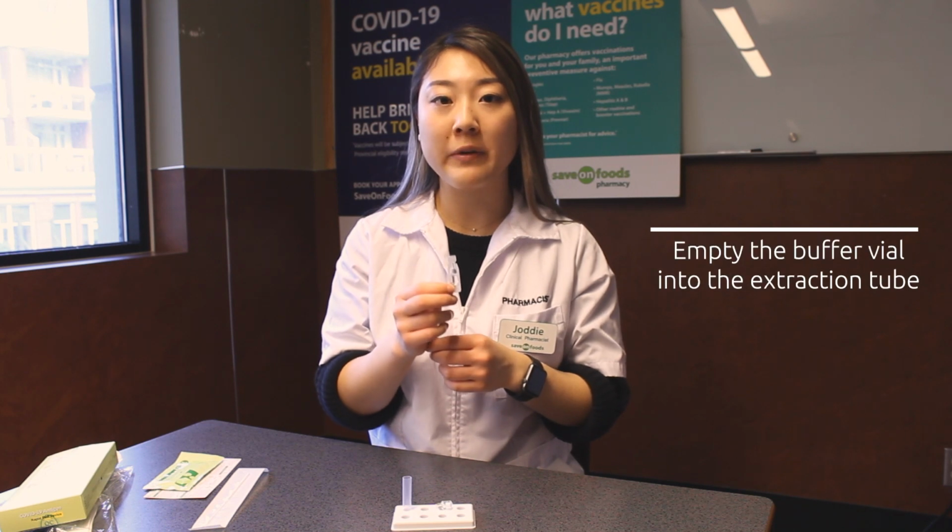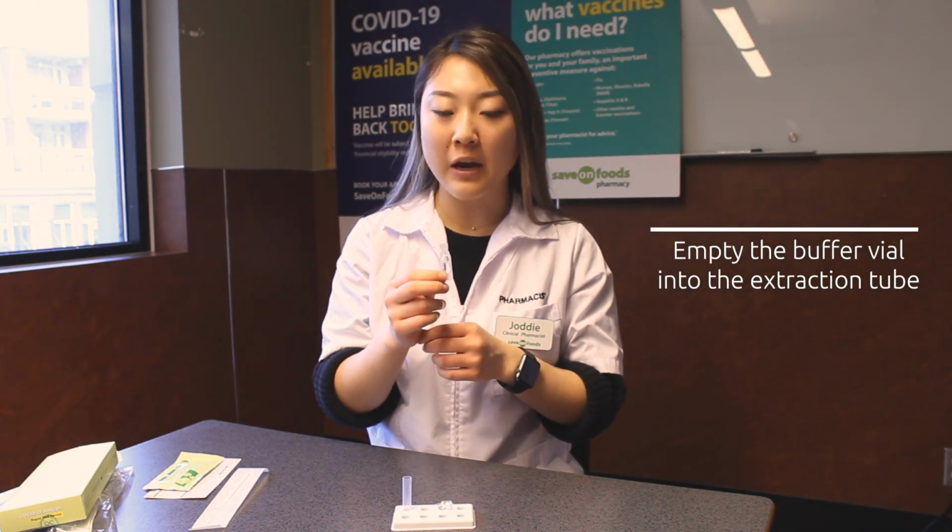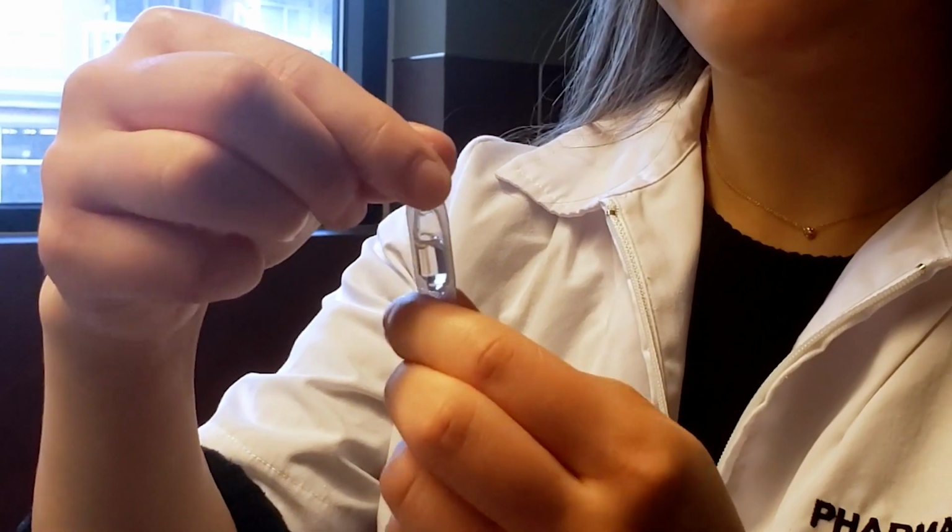So now I'm going to put the buffer liquid inside the extraction tube. You can open this by twisting the top.